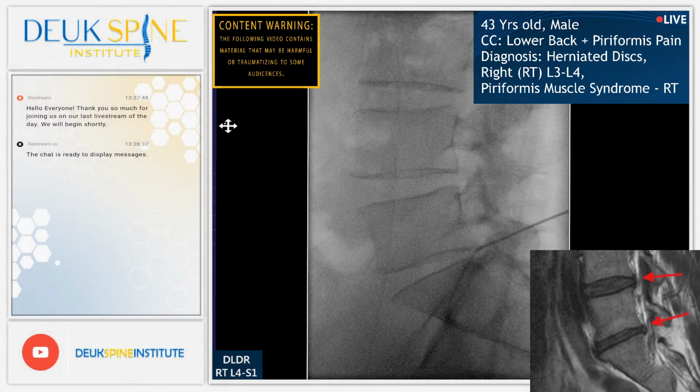But Jordan has gotten the end plates lined up beautifully. I don't really see a good reason why we wouldn't be able to get in right now. But I'm going to go ahead and make my incision, and we're going to get into the L4-5 disc as well. We have 2 discs to repair today, not just 1.